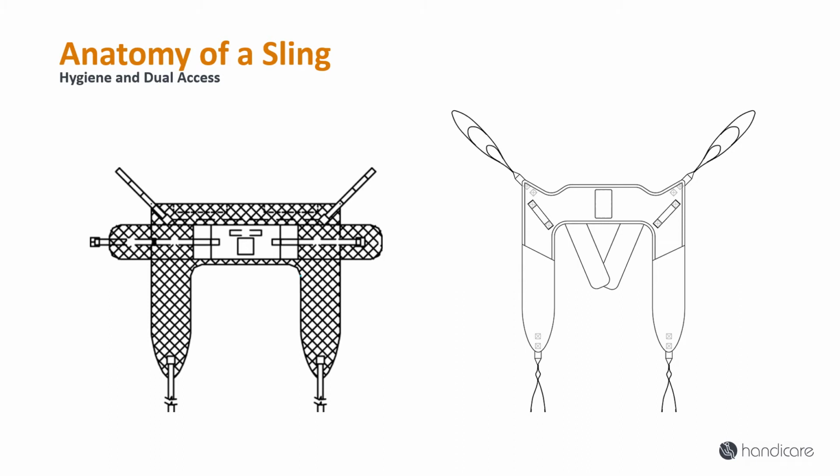With these sling styles, it is important to ensure the resident is well supported in the sling and is able to maintain the seated position throughout the duration of the task to prevent migration through the commode opening. Given the decreased support of this sling style, a resident should never be lifted from the floor or from a supine position in this type of sling.